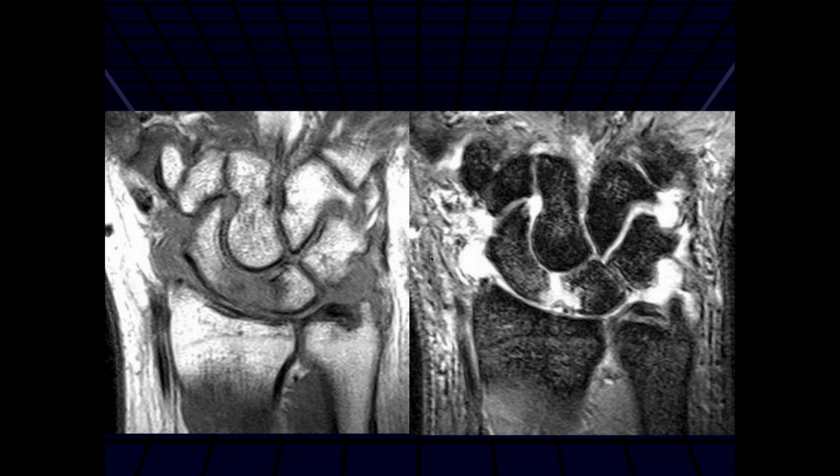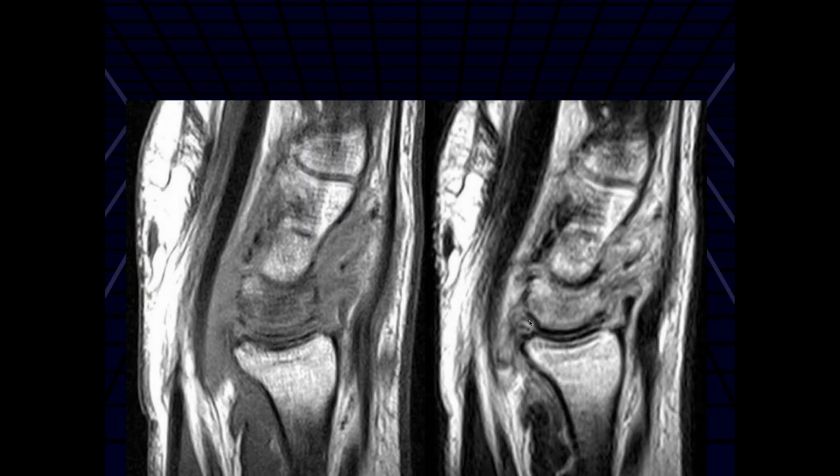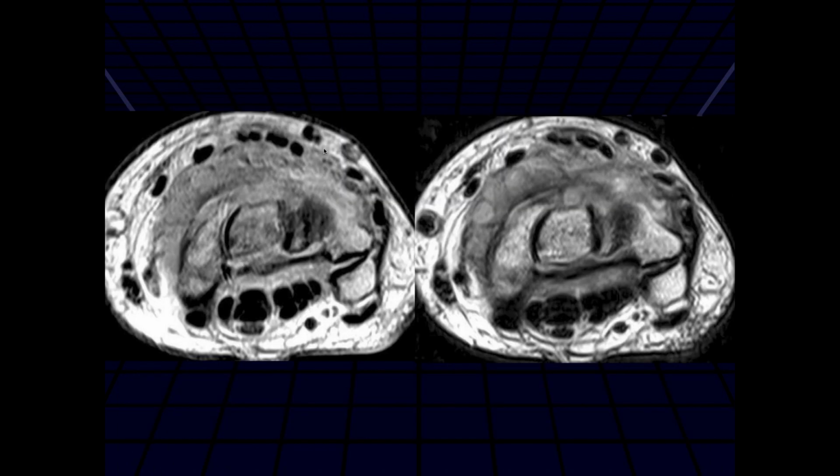Okay, so here we can see an osseous erosion within the radial proximal aspect of the lunate, and also maybe a smaller erosion in the proximal scaphoid. There is a large carpal joint effusion. I think these findings are nonspecific. They could reflect inflammatory arthropathy, synovial thickening. I haven't seen this before, but I guess it could also be gout.